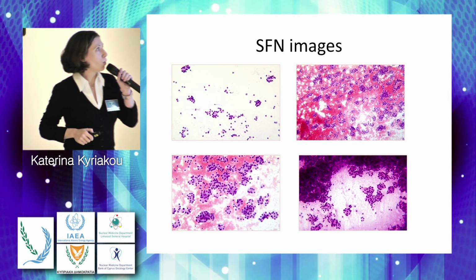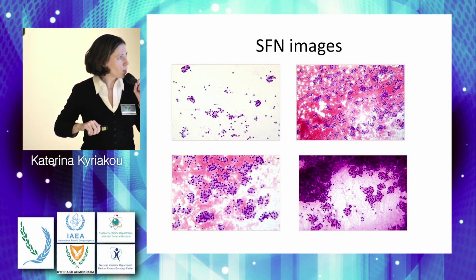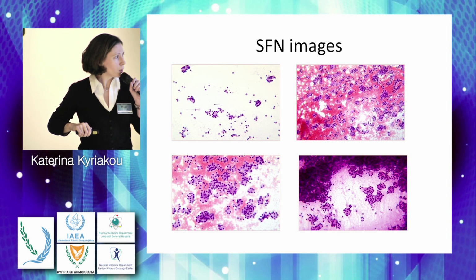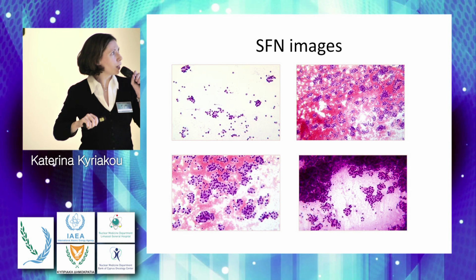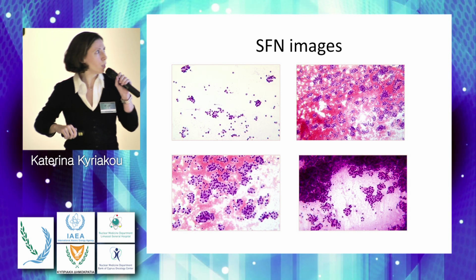A few images of suspicious for follicular neoplasm cases. Here we see the microfollicles, small ring-like formations. Here we see significant cellular crowding and again microfollicles.